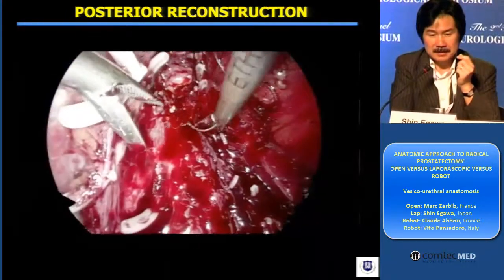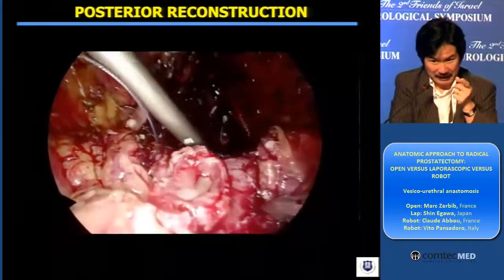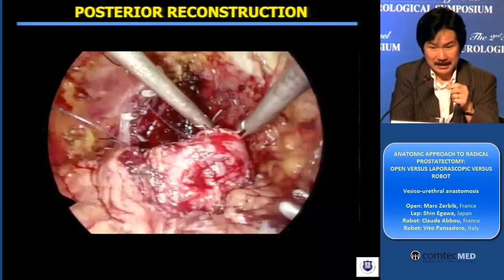And to — I suppose — to the level — you'll see the bladder opening, and you'll see the circular muscle well-preserved of the bladder neck opening.